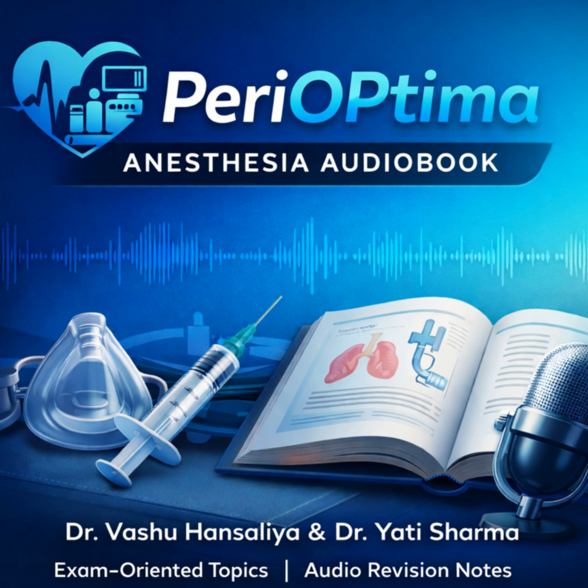4. VCV guarantees volume but risks barotrauma. 5. PCV limits pressure but risks hypoventilation. 6. PSV is for spontaneous breathing, provides an inspiratory boost, and is flow cycled. That's a key Viva point.